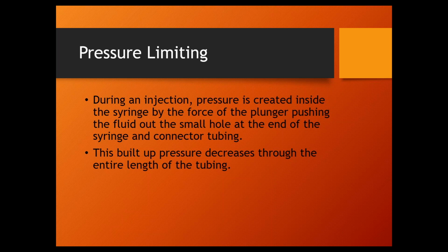Now, one more thing, and then we'll move on. Let's say we do hit our pressure limit. I just talked about infusion pumps: when they hit their pressure limit, their occlusion pressure, whatever they refer to it as, the infusion pump stops. That is not the case with contrast injectors. If we hit our pressure limit, let's say we've set it to 300 PSI, and during the injection we hit 300 PSI, the injector sees that, it does not stop the injection.